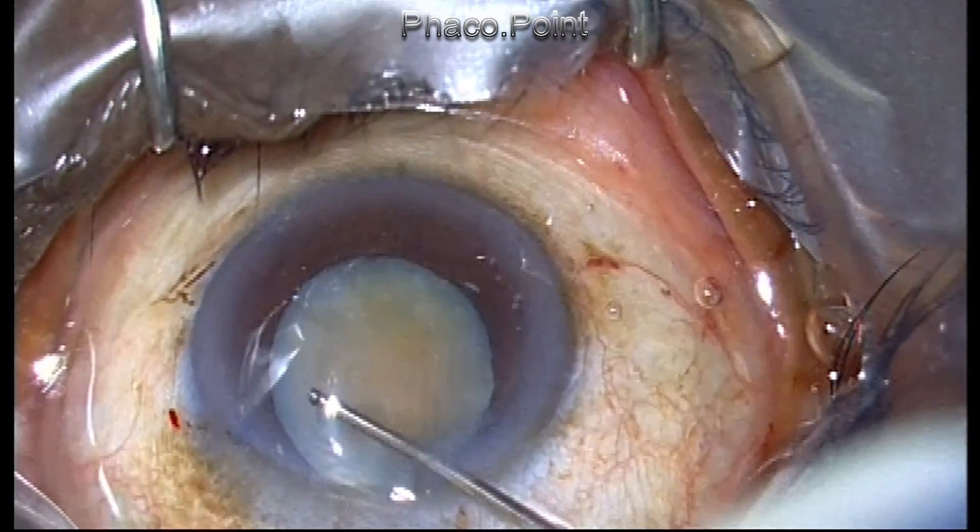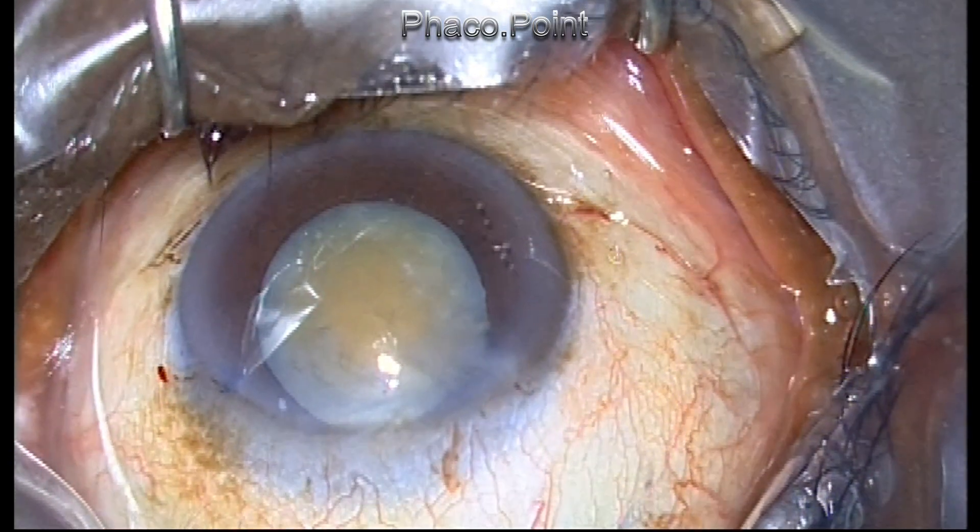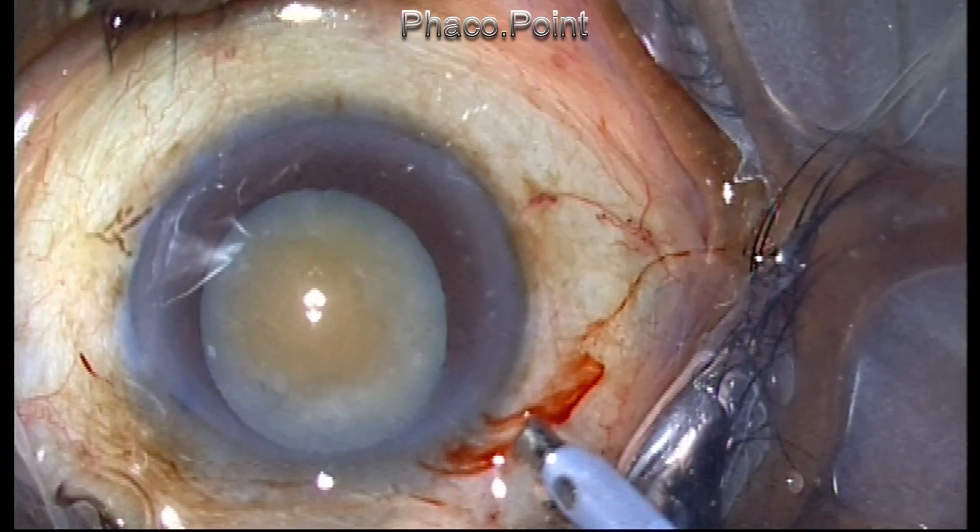The cortical cleavage hydrodissection is superfluous — you need not do it — but it can help you to unmask the underlying hardness of this nucleus.